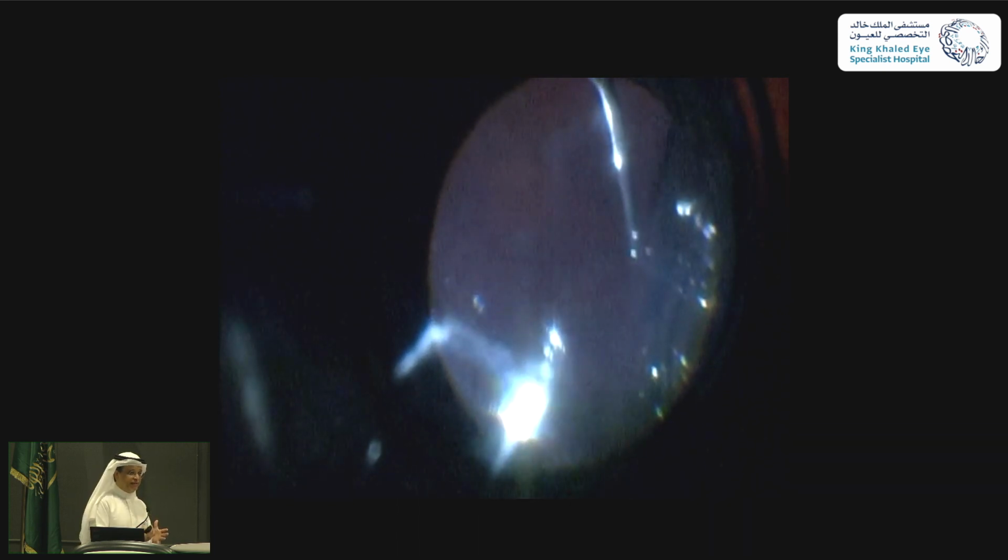So they release all the traction around the break with active vitrectomy, aspirating the subretinal fluid. This is different from pneumatic, as the retina becomes flat inside the procedure. In pneumatic, we inject gas and wait for the gas to push the fluid out. But in this, it is a controlled condition.